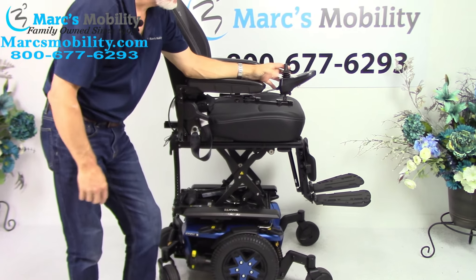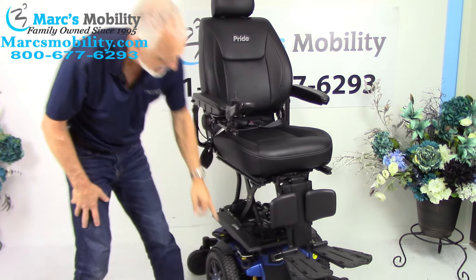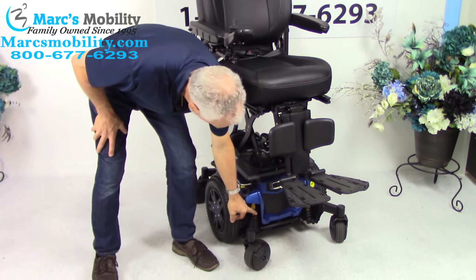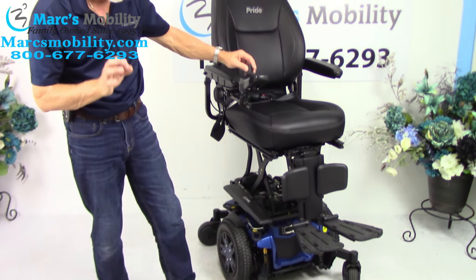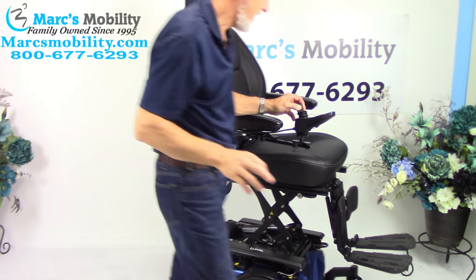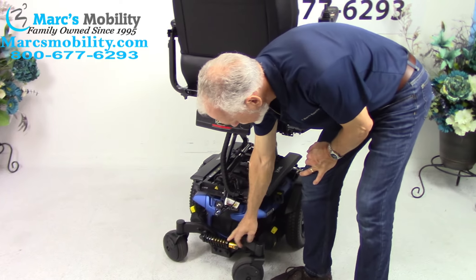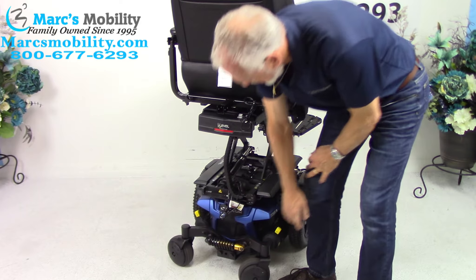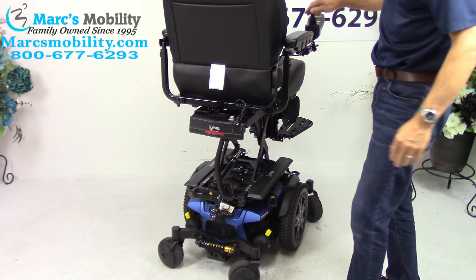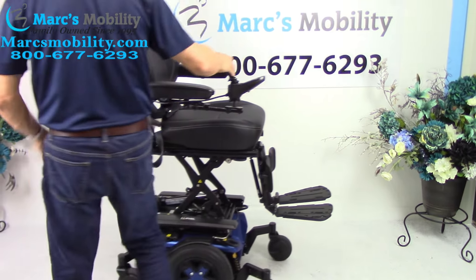The next thing is the suspension. You can see the suspension in front — there's one here and two in the front — heavy-duty suspension. You have the same heavy-duty suspension in the back for the rear fork. It's a heavy chair as you can see when I raise it up.